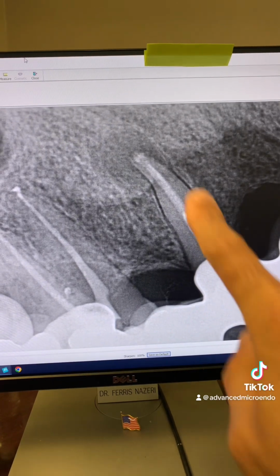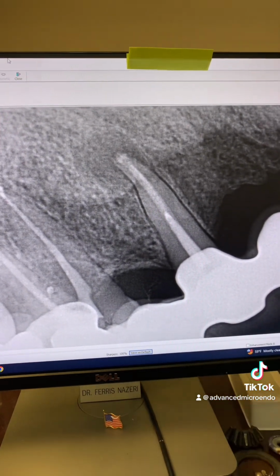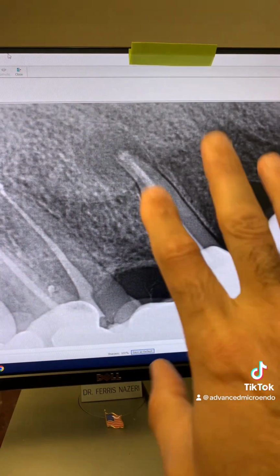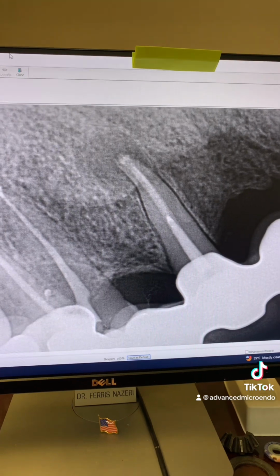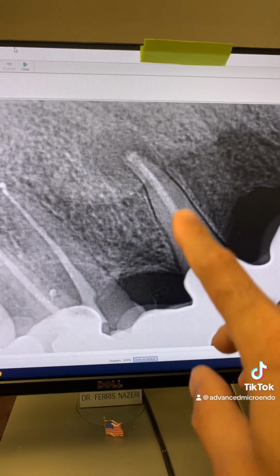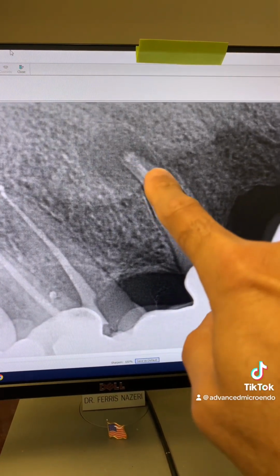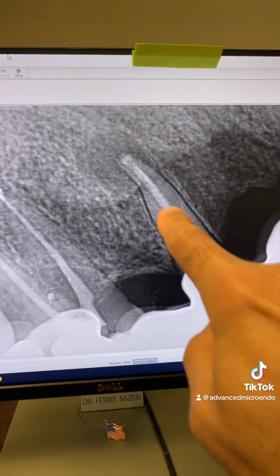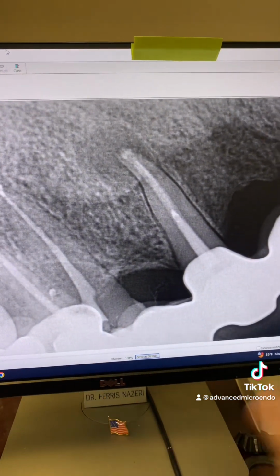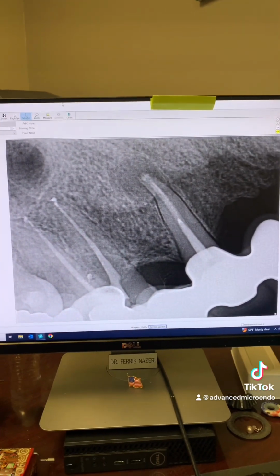And this is tooth number 7. Again, we went through that 8-unit bridge, removed the old gutta-percha, and cleaned it out, irrigated with full strength 6% sodium hypochlorite copiously. The apical diameter was over 50, so I placed an MTA plug followed by gutta-percha and sealer, temporized both teeth, and referred the patient back to his dentist for the permanent restoration.